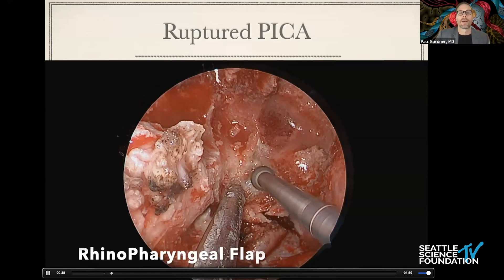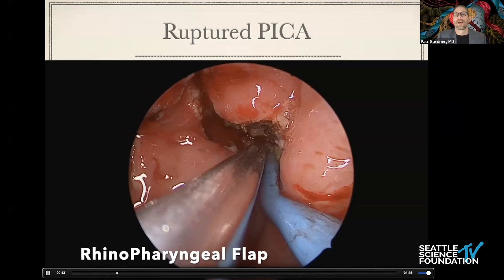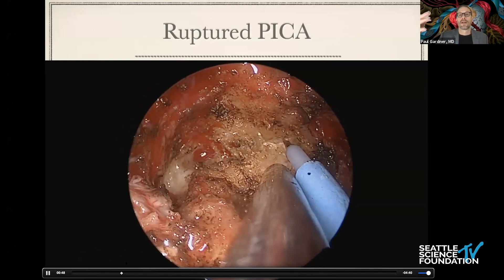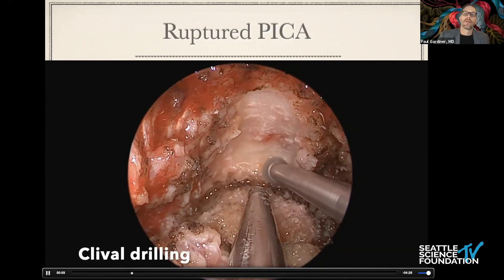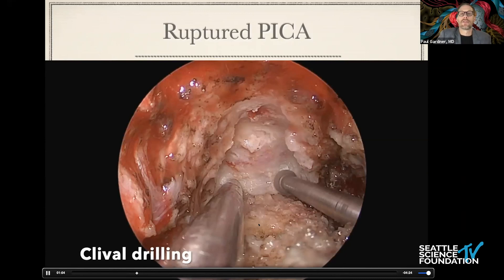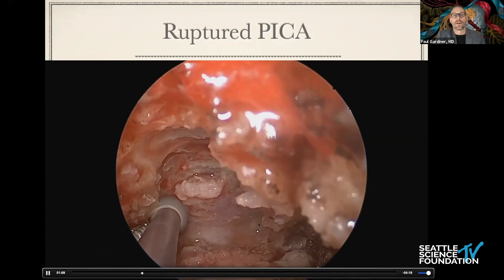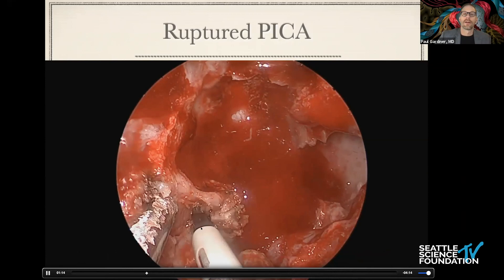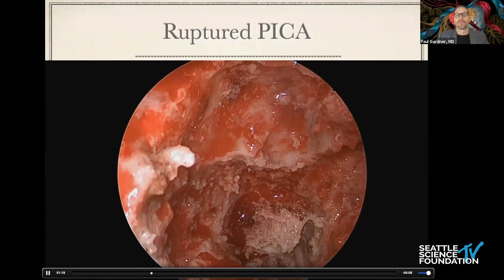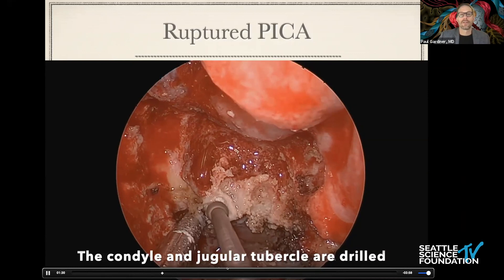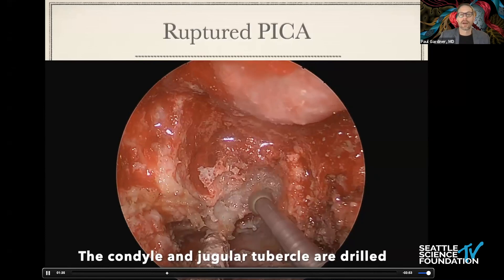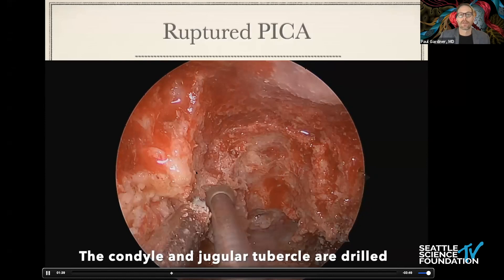Here we're doing an inverted rhinopharyngeal flap, a nice adjunct. By preserving all of this tissue between the nasopharynx and oropharynx, we pretty much eliminated the risk of a leak through the mouth, which was a problem initially when we were resecting all that tissue. Drilling down to the foramen magnum after dissecting free the basopharyngeal fascia. I can disconnect the eustachian tube attachment — not transecting it, just disconnecting — allowing me to drill immediately next to and below foramen lacerum, exposing the jugular tubercle. This is the far medial exposure, complementary to the far lateral.